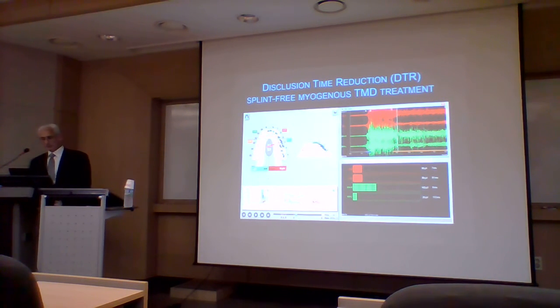So when we have this companion EMG, we can see what the occlusion is doing to the muscle physiology at the same exact time.